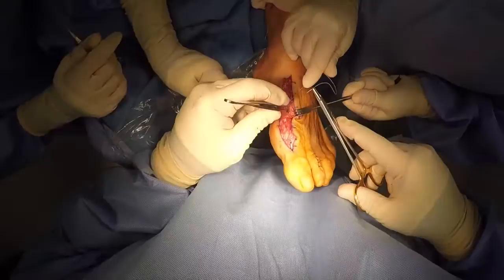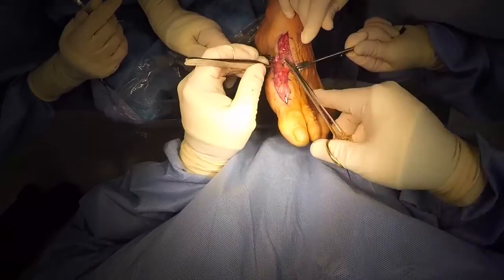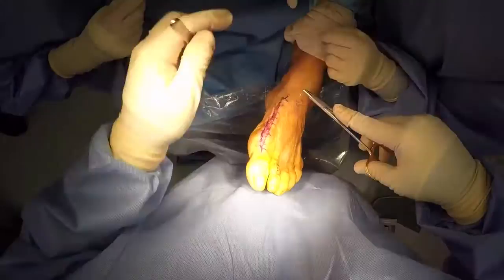So as you can see, with our running suture technique, we're able to get excellent closure of the deep tissue over the plate. We utilize 4-0 Vicryl to approximate the deep subcutaneous tissue, and then 5-0 Vicryl for the skin, and then place the patient in the cast.